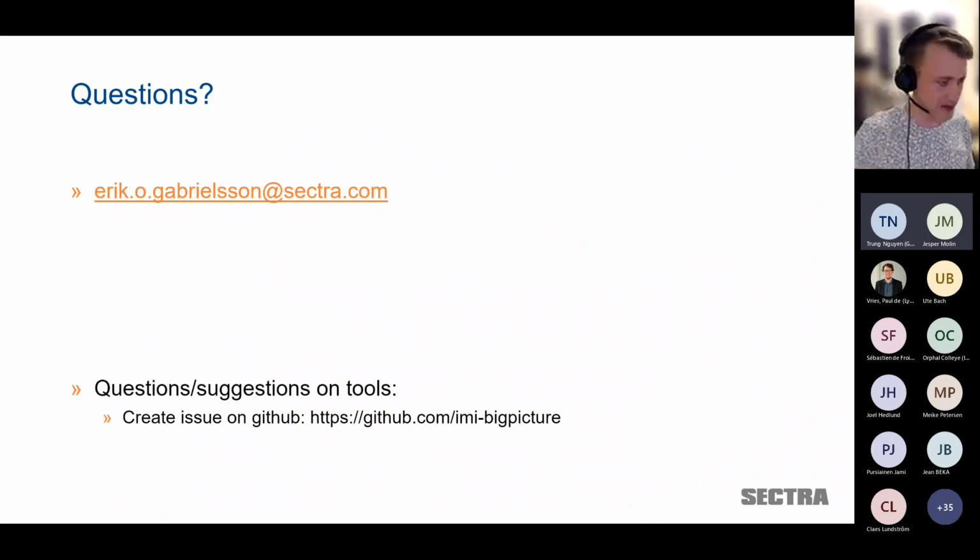Okay. Thank you, Eric. We have some remaining questions from the chat, and maybe we can take them from top to bottom. The first one is, I assume Z-stack scans can be saved in DICOM format. If this is true, is the reader able to read in all Z-stack layers? Yes. You can save stacks in separate files in DICOM, and we see DICOM can read these stacks and also read multiple optical paths.